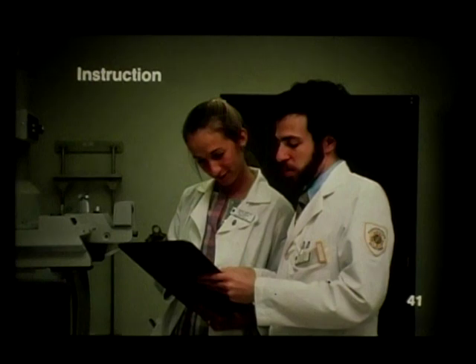Number 41. The new radiographer's introduction to the department should include spending 2 or 3 days rotating in a few of the radiographic rooms. Rotation allows the radiographer to become familiar with the various radiographic units with which he or she will be working. The quality assurance technologist or another designated individual can provide instruction. The instructing radiographer will demonstrate a procedure, then assist and observe the new technologist. Errors may then be corrected before the new radiographer attempts to work alone.